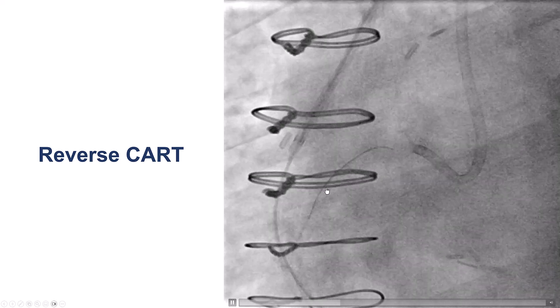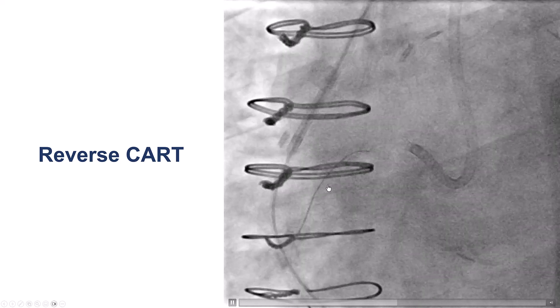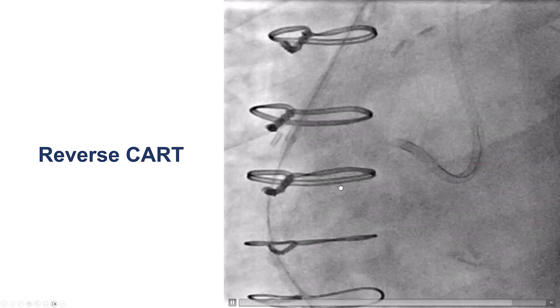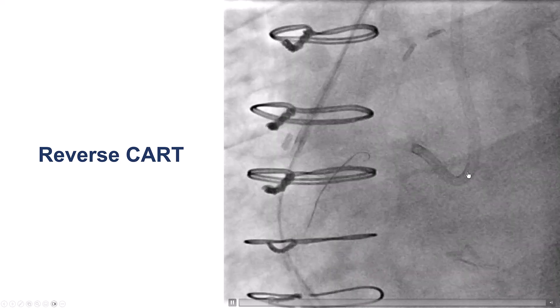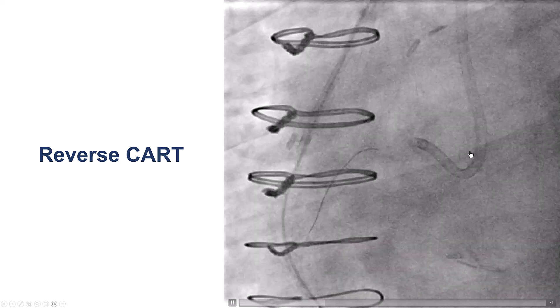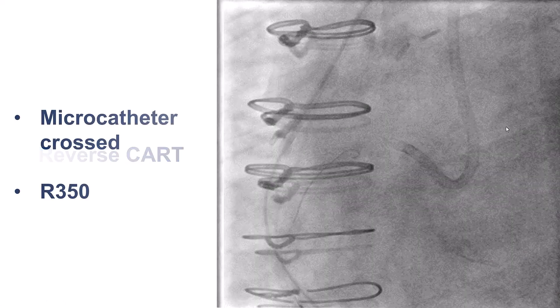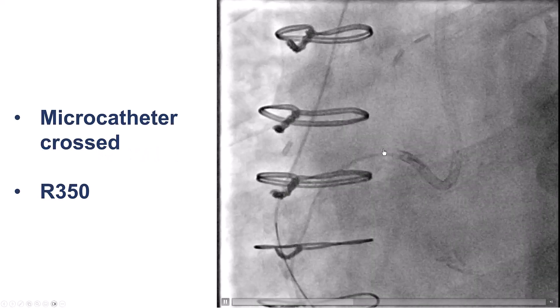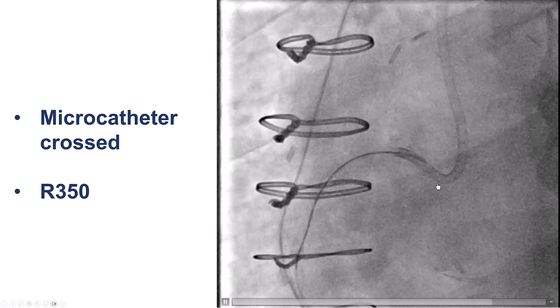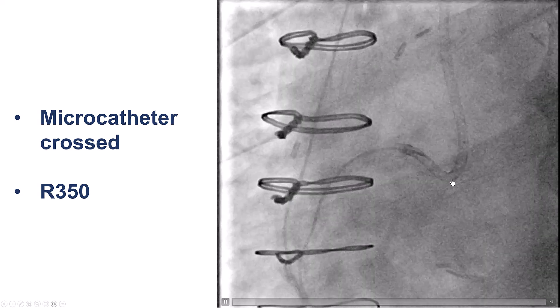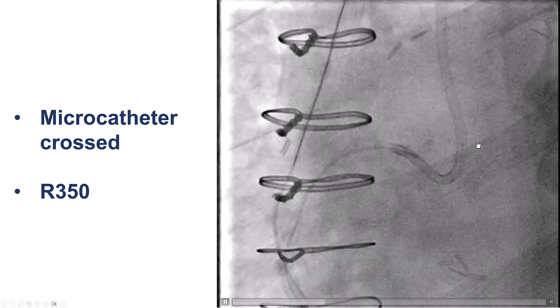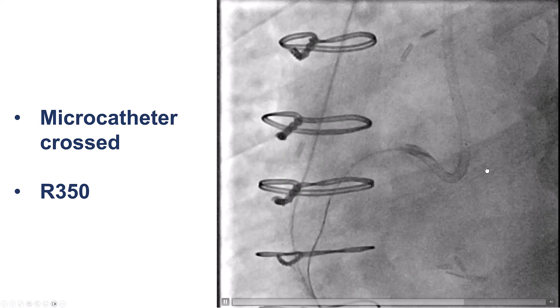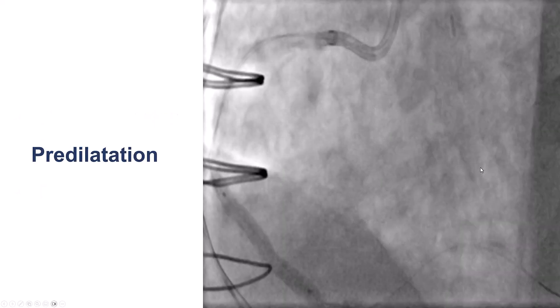We performed reverse CART again. This time we did not need the guide extension — the retrograde wire was advanced easily into the antegrade guide catheter, and we were able to advance the retrograde microcatheter into the antegrade guide catheter and externalize an R350 wire.